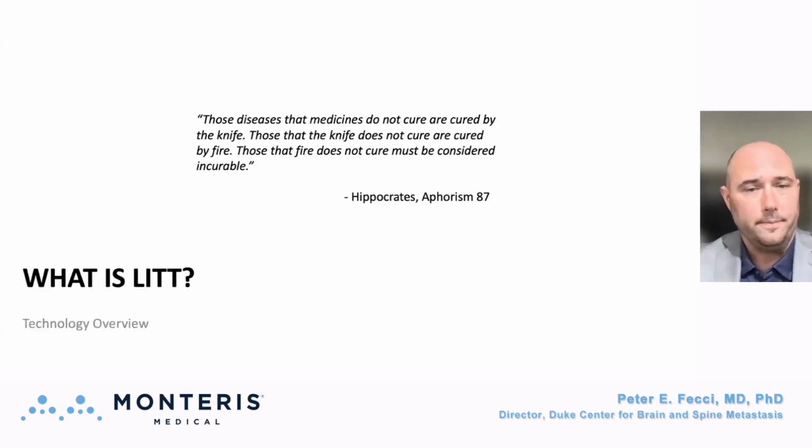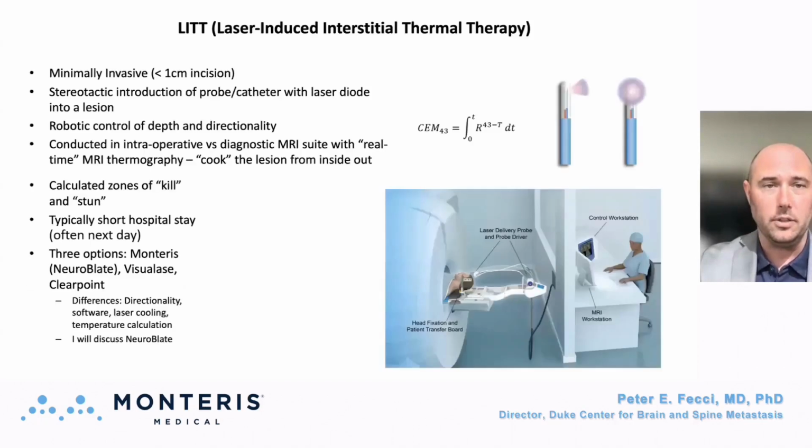So on to what is LITT. Admittedly, the idea of using heat in medicine is not new. However, the LITT technology is clearly a much newer rendition of that. And it's important to note then that LITT is exactly that. This is a thermal ablation technique. So although it uses a laser, the mechanism of kill is actually with heat.